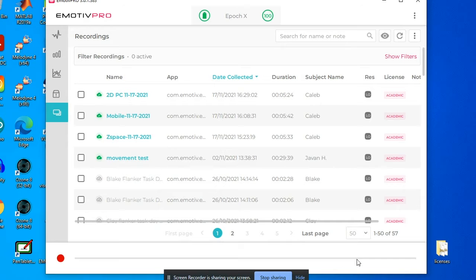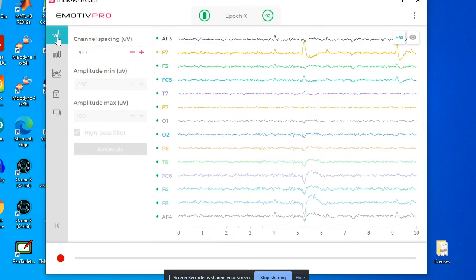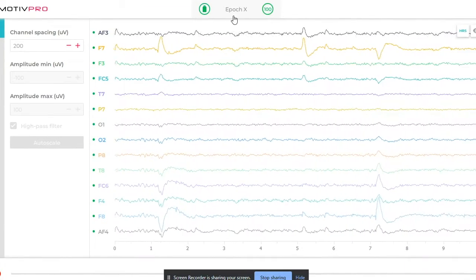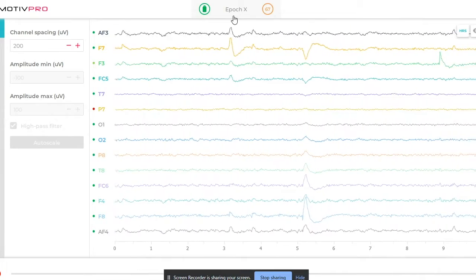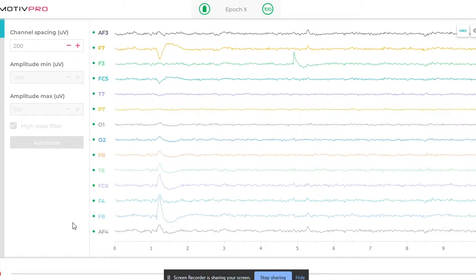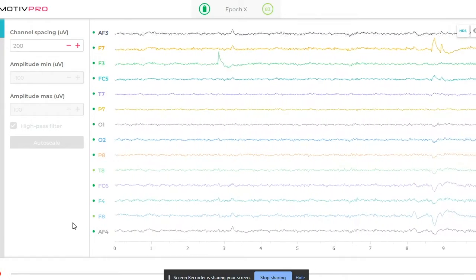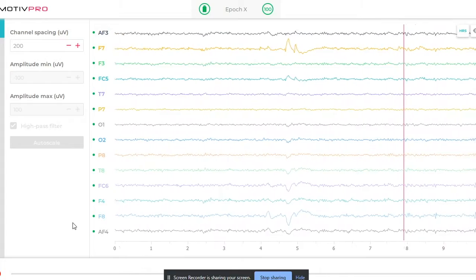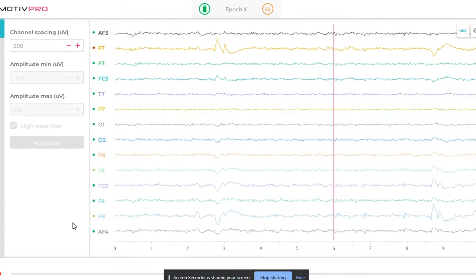During this time, the EEG signal could be monitored using the tab to the top left. This would show all of the electrodes with good connection quality and the signals in accordance to time. As is observed, all 14 electrodes have signal quality for each electrode in accordance to the 10-20 electrode placement and the 14 channels of the Epoch.